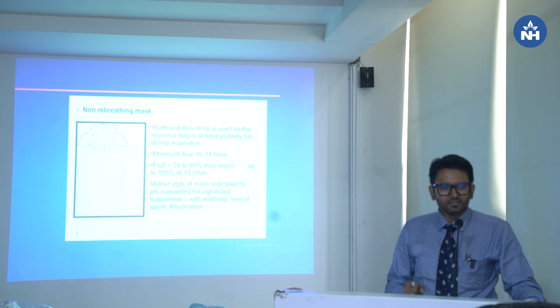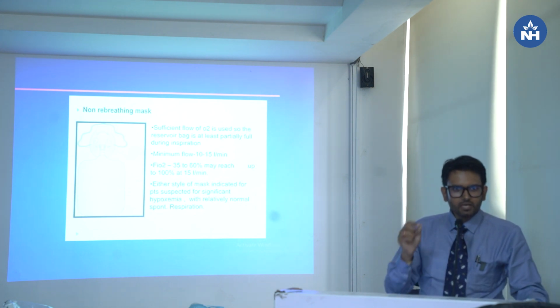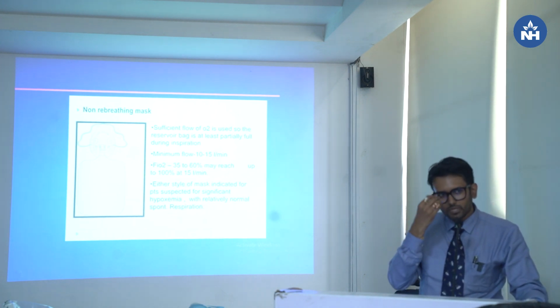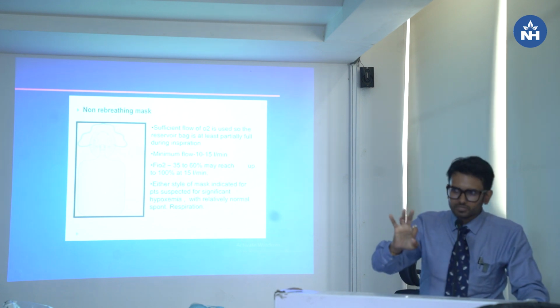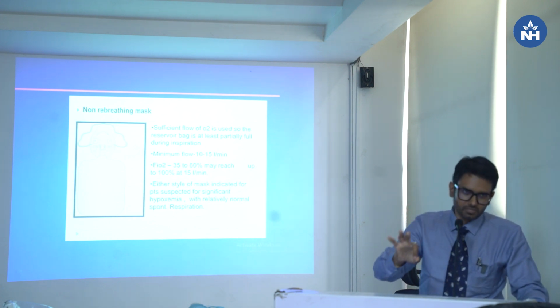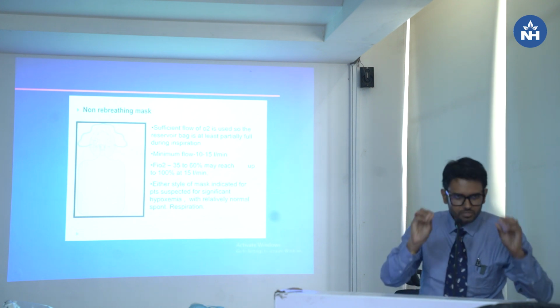Good. So we have to give oxygen as much as to avoid rebreathing. For nasal cannula, our own nasopharynx is a reservoir, a natural reservoir. So basically, how much oxygen will I give, what is the saturation, and that the patient should not rebreathe. So this is the basic thing. And whether the patient is able to take the oxygen. So these are a few more things. Thank you.